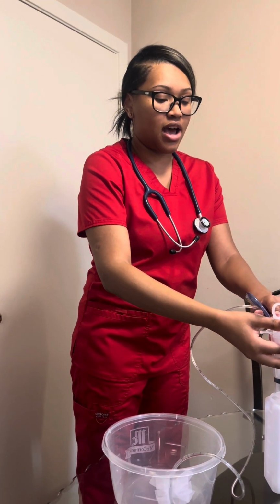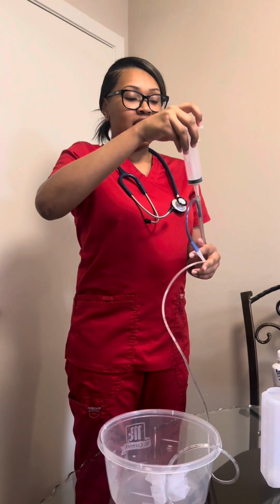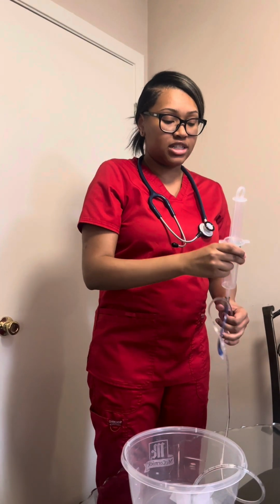And I would check the pH of it, which should be less than 5.5. And then I will continue to do this until I have gotten all the gastric content out.